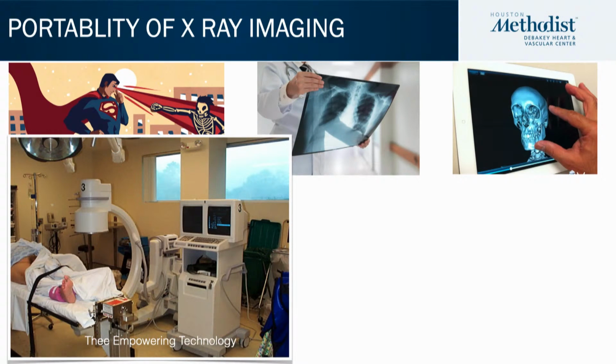But what I believe is the empowering technology in vascular surgery was portable, electronic, live imaging. That's a picture of my operating room when I was at Emory. First of all, it had windows, not a great thing when you're trying to do endovascular procedures, but it was a great view.